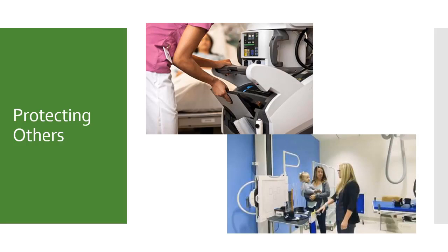When others must be in the room, for example with a pediatric patient, it is the technologist's responsibility to ensure they are properly shielded. It is policy of the program that students may not, repeat, may not be in the room to assist in holding patients or imaging devices during radiation exposures. For mobile and fluoroscopy examinations that require personnel and students to be in the room during radiation exposures, it is the technologist's responsibility to ensure that the principles of time, distance, and shielding are properly being used by everyone.